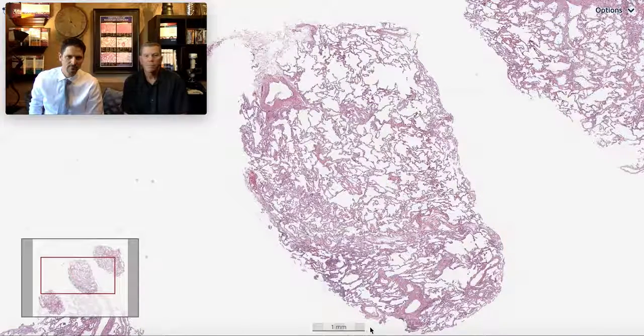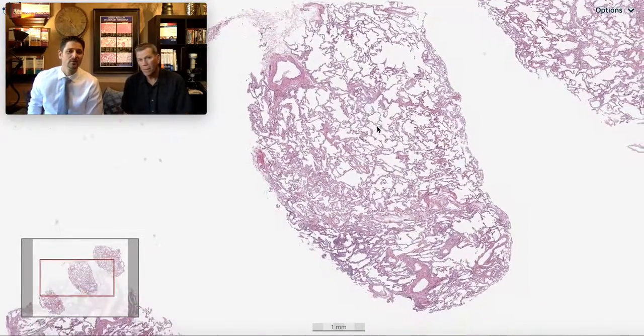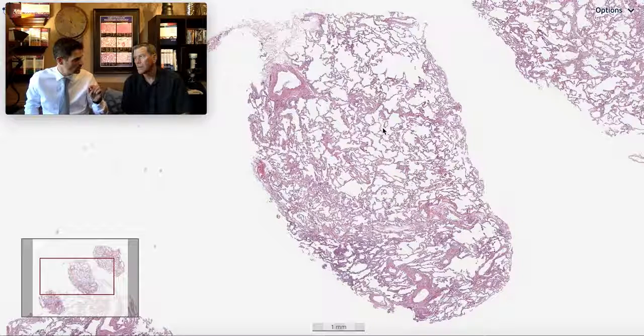Exactly. So this marker right here is one millimeter, so you can imagine we're dealing with a fairly large biopsy. So how do they take these? They put a freezing probe through the transbronchial scope, advance the probe out to the pleura, come back about a centimeter, and then press the pedal on for six seconds.